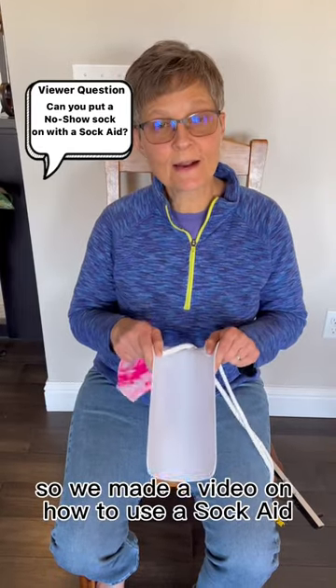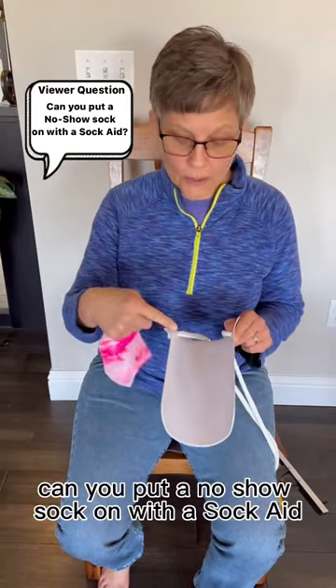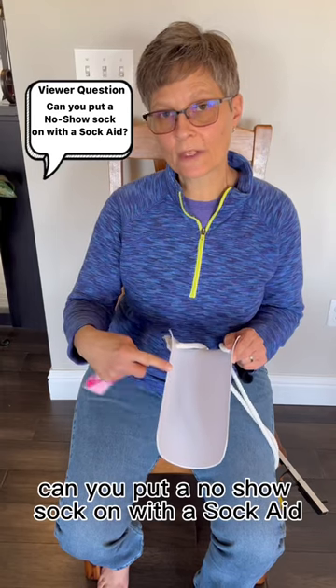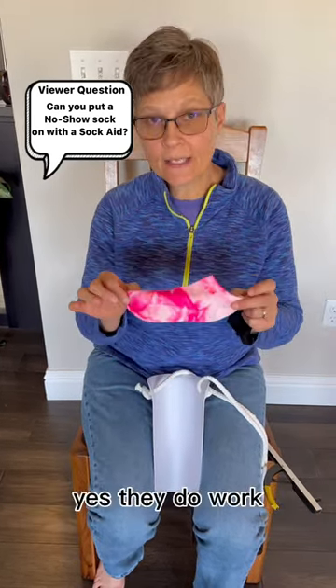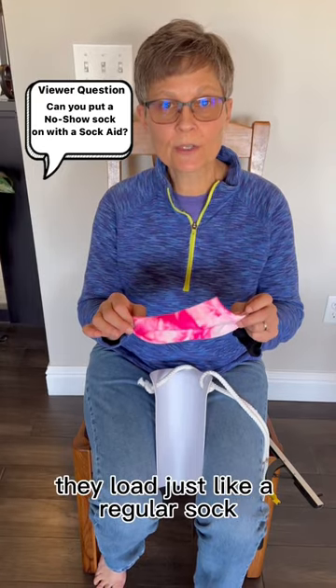So we made a video on how to use a sock aid. We had a viewer ask, can you put a no-show sock on with a sock aid? These little anklet socks — yes, they do work. They load just like a regular sock.